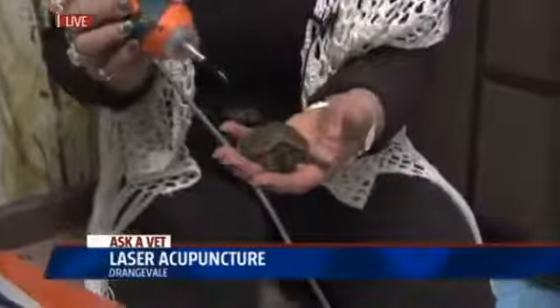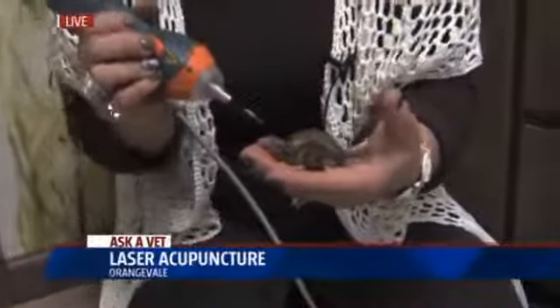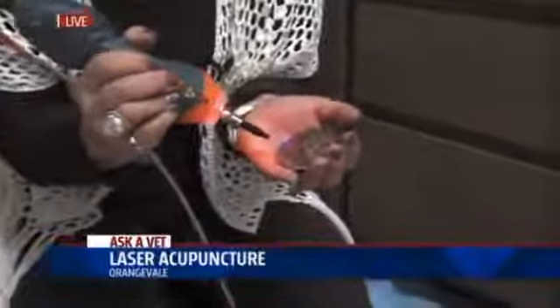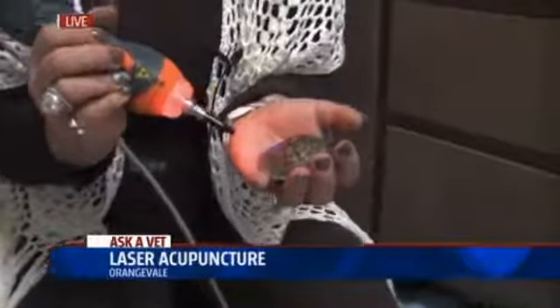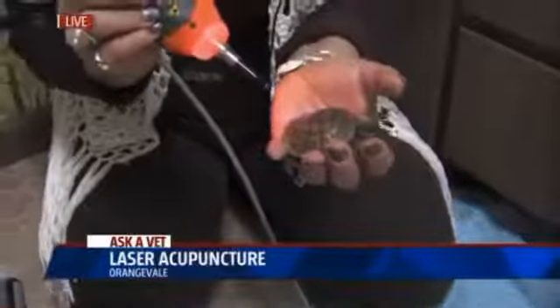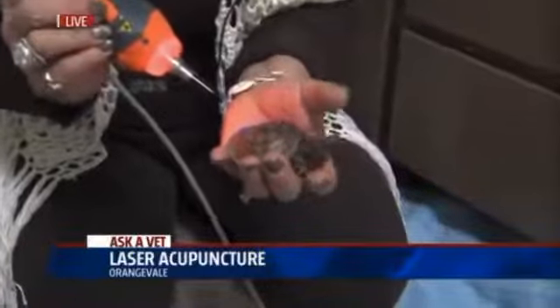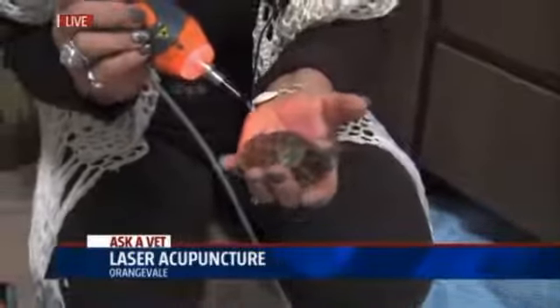Paul and Bethany, I wanted to show you this little guy here because this laser is now okay to use for exotic animals. Isn't he cute? He's not wearing goggles, though, Jill — we need to get safety goggles for the little turtle, but you can cover their head or face them the other way. And actually, this also works on shell injuries, mouth rot in reptiles. It also has settings for inflammation and back pain — it doesn't just do laser acupuncture. It has a whole myriad of things that you can do.